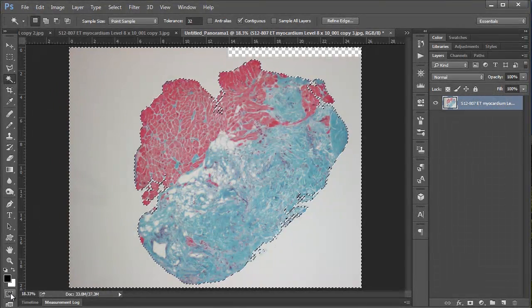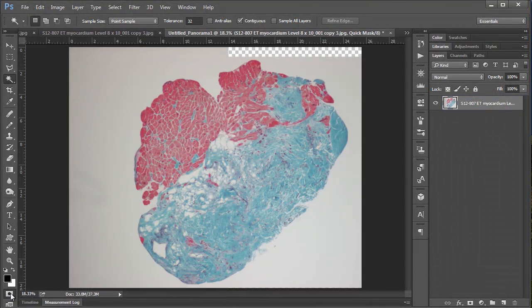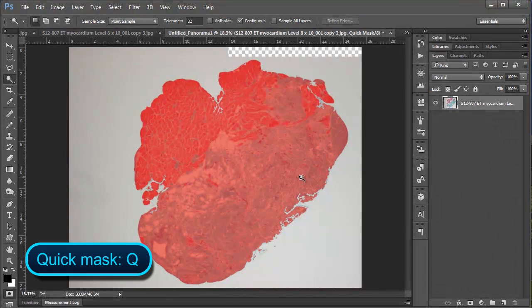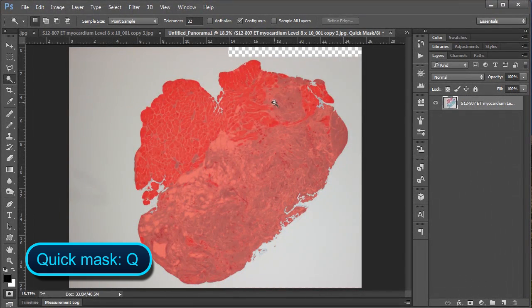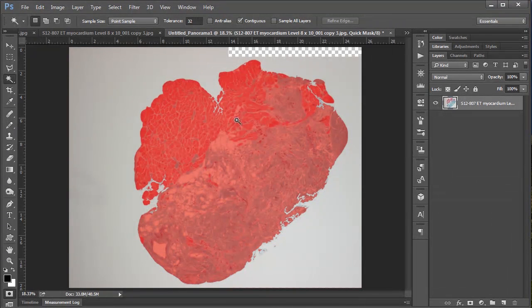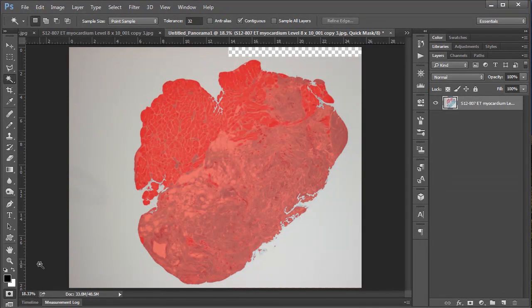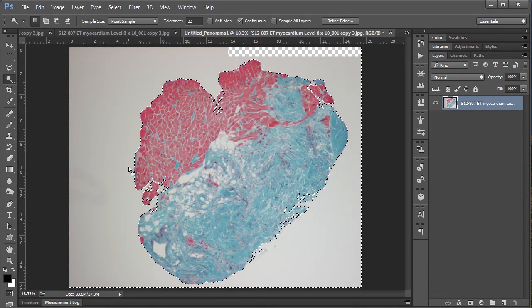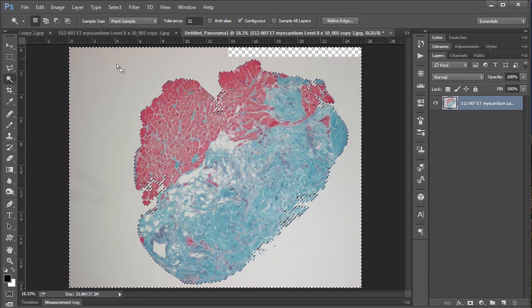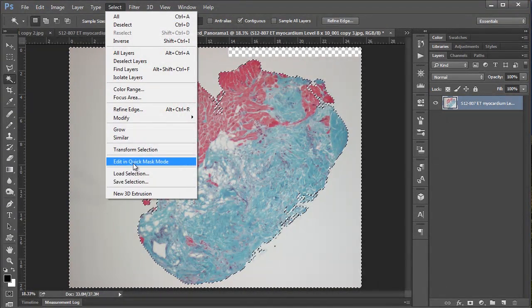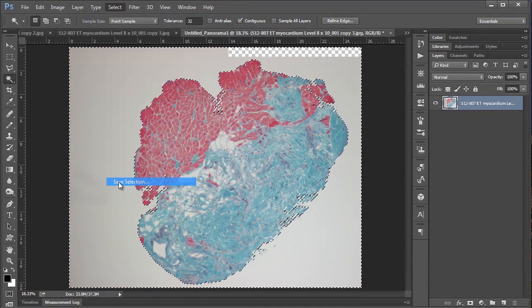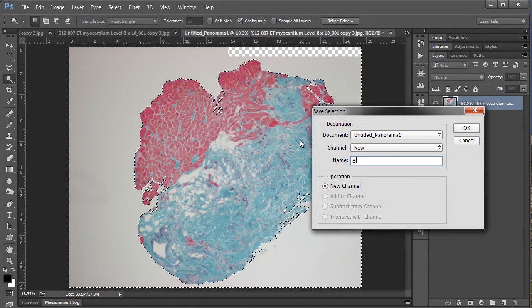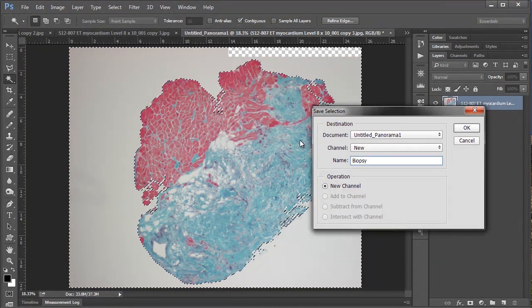If I want to check it I can go down to the quick mask mode or I can push Q. And that gives an overlay of in this case what isn't selected. Which I'll come back to and explain in a second. But for the most part this looks pretty good to me. So I'm going to exit quick mask mode. And I want to save this selection as an alpha channel. So to do that you go to select and say save selection. And in this case I'm just going to call it biopsy and hit enter.